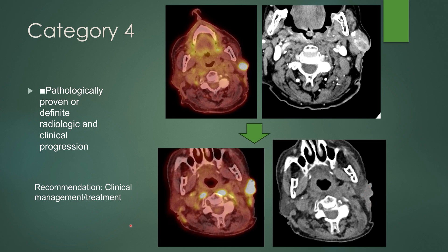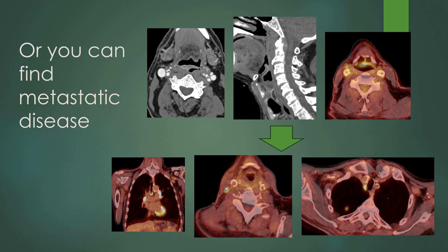On follow-up imaging, you can find the unexpected — like new metastatic disease. This patient has cancer of the epiglottis, with irregular nodular contour of the right aspect of the epiglottis extending to the aryepiglottic fold and avid FDG uptake. On follow-up post-treatment, this patient did well at the primary site but now has level 3 lymphadenopathy, paratracheal mediastinal lymphadenopathy, and pulmonary nodules.